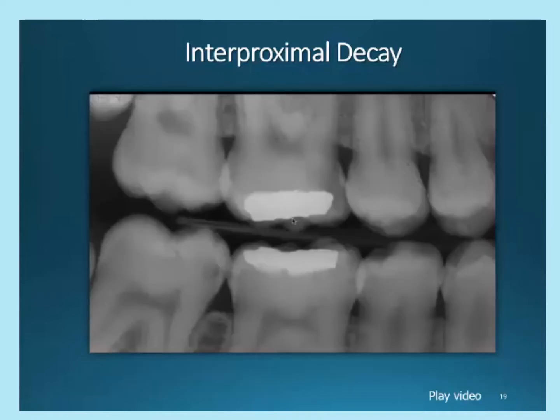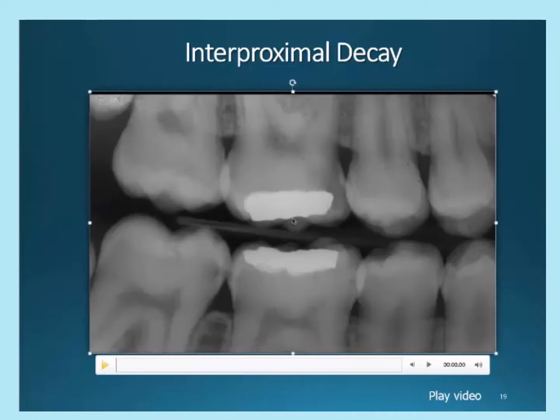Take a moment to view this presentation. The radiographic image of a tooth is one of smooth, unbroken contour with uniform densities of enamel and dentin. Observed changes in contour and/or density may indicate pathosis. In this bitewing radiograph, the density of an area of enamel on the distal of tooth number 30 has changed from radiopaque to radiolucent, indicating tooth structure has been lost.